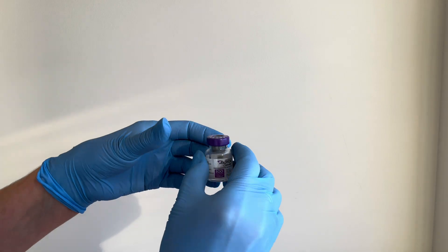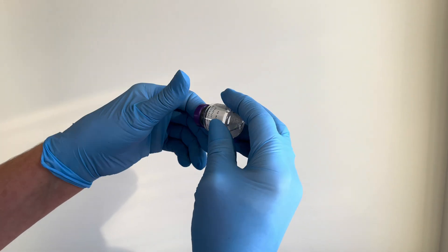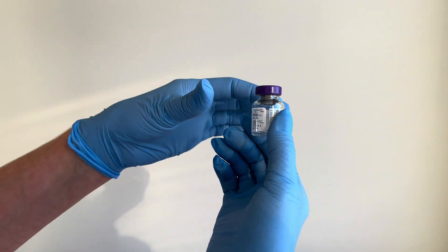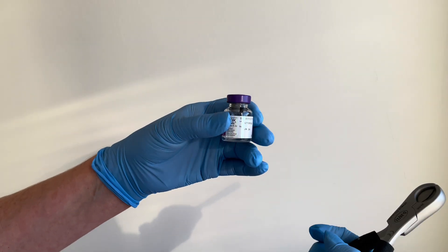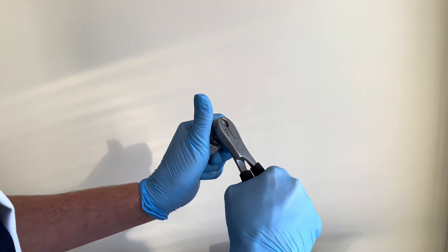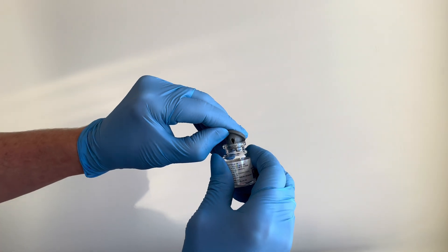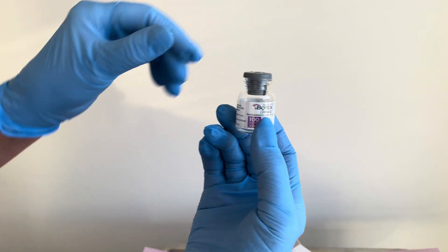Then you're going to push in your saline, take that out, and just roll it around a little bit. You don't have to agitate it — if it was a Xeomin you would turn the vial up and down, but with Botox you just want to gradually mix it around the sides. We use this Kevy decapper to take the cap off, and then you can access your neurotoxin with your little BD syringes.